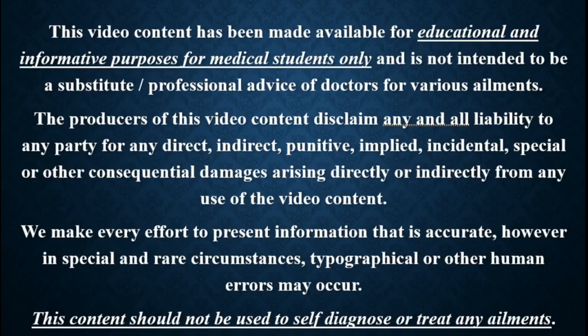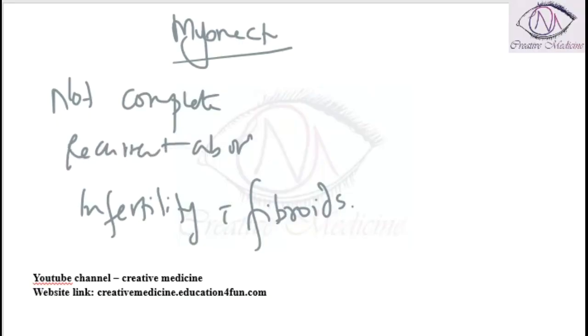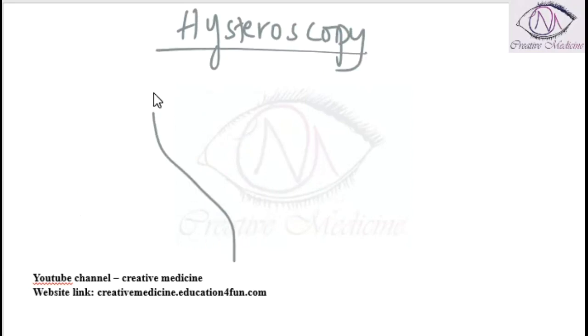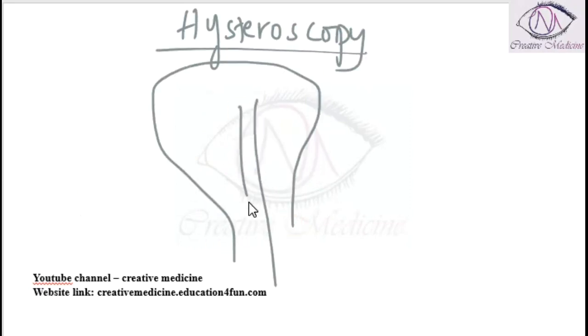In this lecture, we will learn about hysteroscopy. Hysteroscopy is used to visualize the inside of the uterine cavity. While using a hysteroscope, always use a distension media.